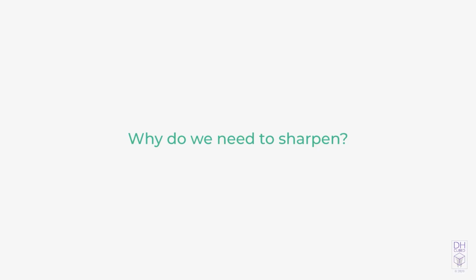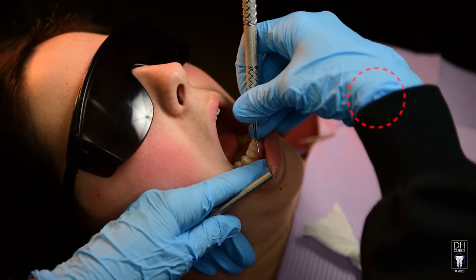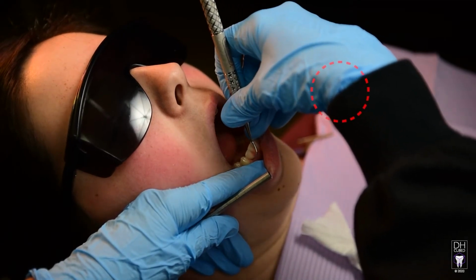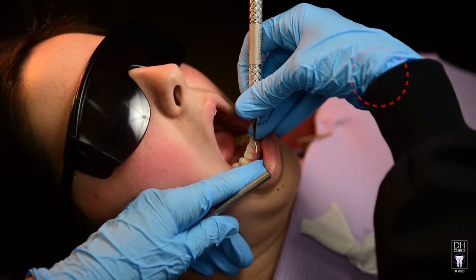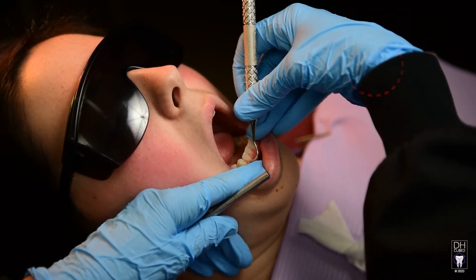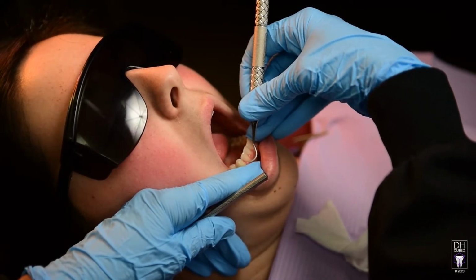Why do we need to sharpen? Using sharp instruments is the primary way to prevent hand injury to the hygienist. Notice how this hygienist's wrist is not neutral. She's trying to close the blade in an attempt to get it to bite the tooth surface. She has to keep closing the blade in the attempt to get the instrument to adapt.